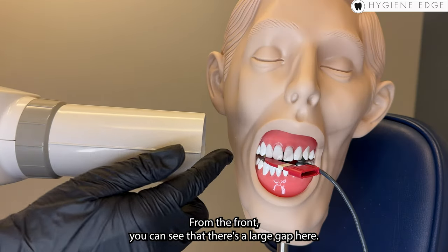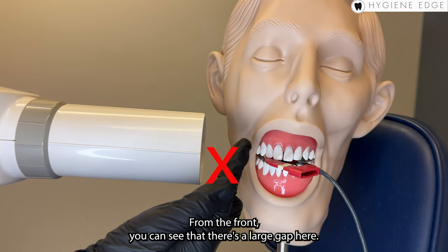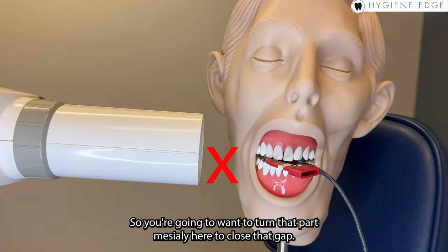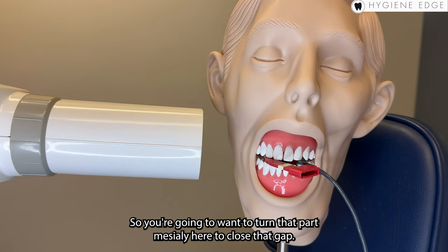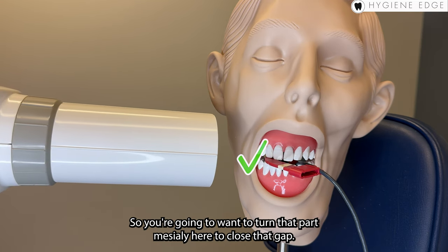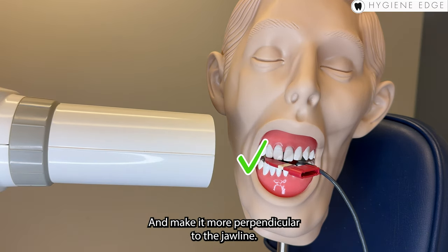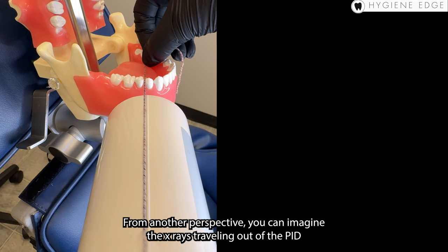From the front, you can see that there's a large gap here, so you're going to want to turn that PID mesially to close that gap and make it more perpendicular to the jawline.